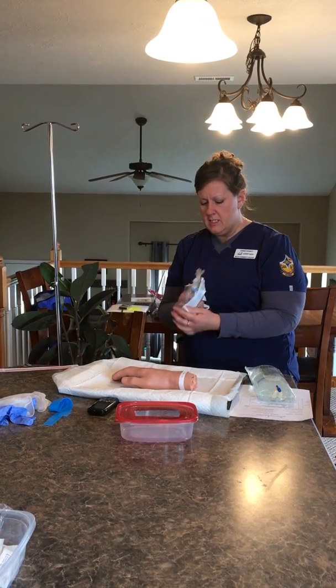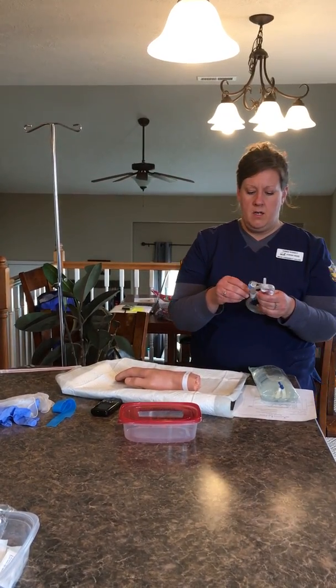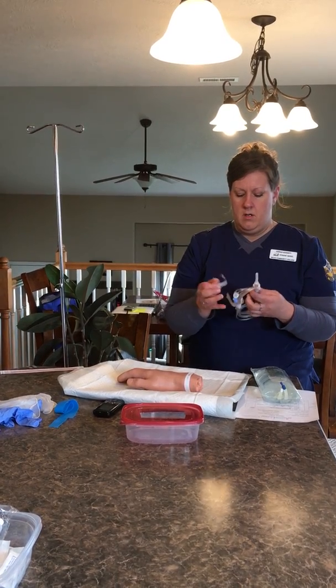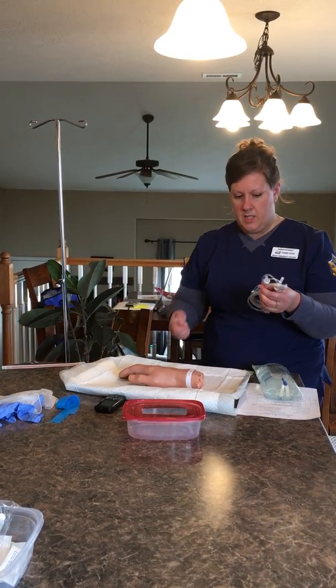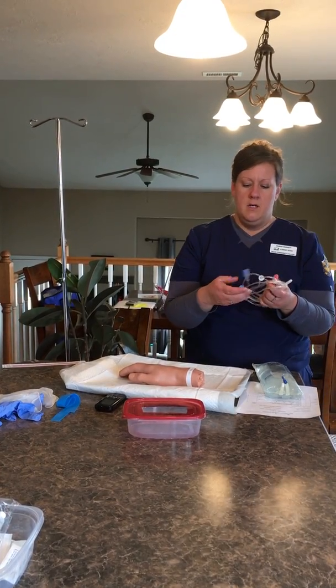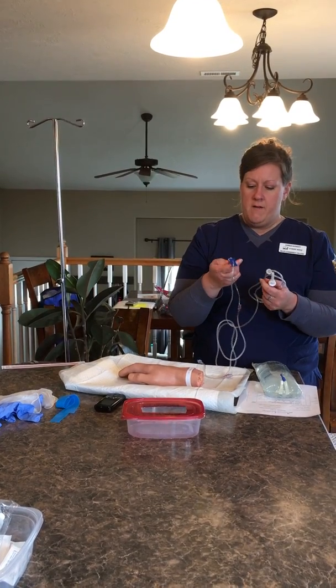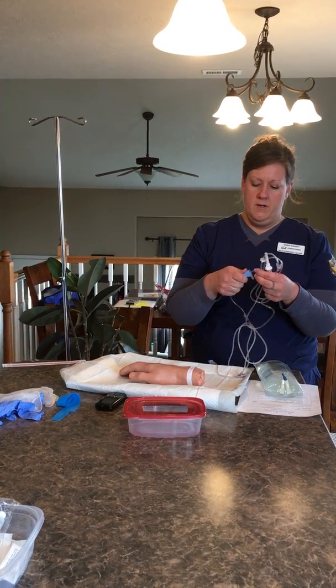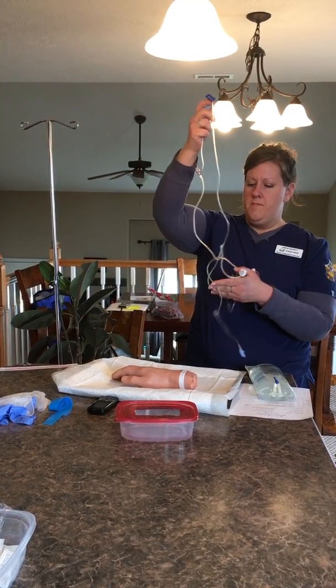When opening these, I want to make sure that everything is intact, and I'm also making sure to keep the clean ends clean. I'm going to first close the valve so that we don't have solution flying everywhere.